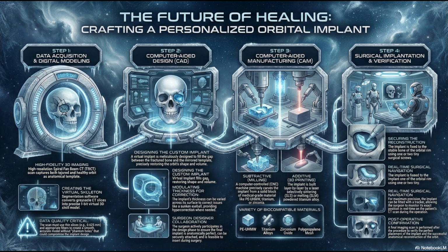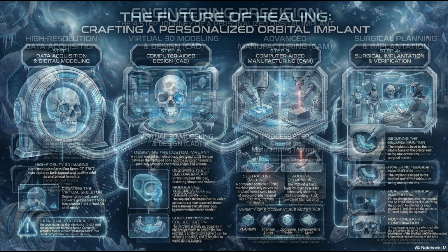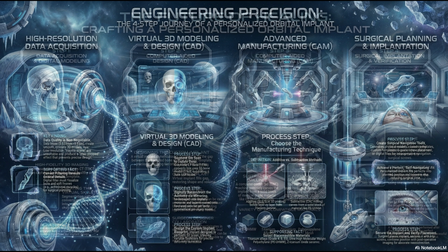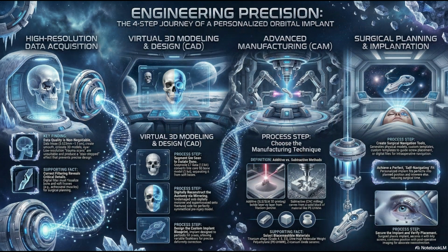I get the engineering challenge, I do. But let's bring it back to how that initial data can undermine even the best engineered implant. Think about a custom titanium mesh. It's modeled perfectly on a digital file. It's pre-bent on a 3D printed model. It looks beautiful. But if the geometric fit from that initial CT data was just a tiny bit off, you are still facing a huge risk of surgical failure.